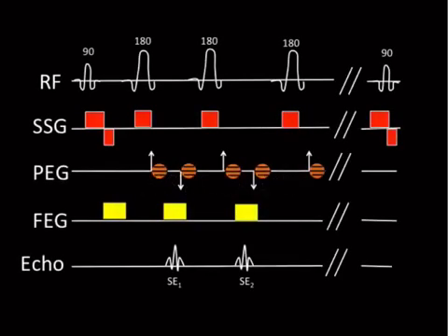Now there's different types of fast spin echo, and that's what's done more modernly. So it's a little bit different. Looks something like this. So it is a spin echo sequence. So how do you know it's a spin echo sequence? Because we do 90 followed by 180. That defines a spin echo sequence. So when you see that 90 and then 180, you're in the spin echo world.